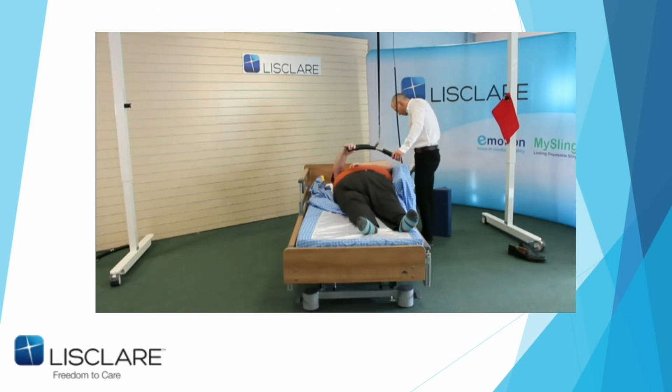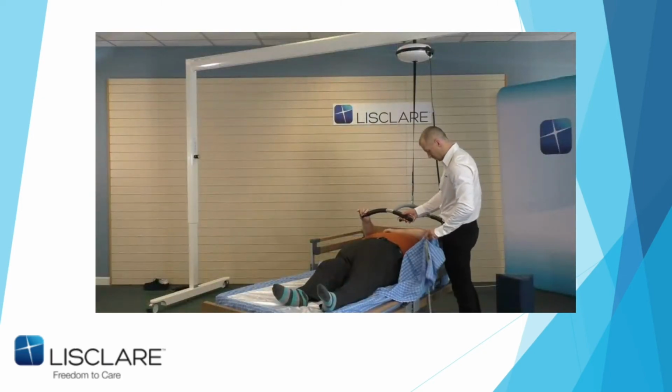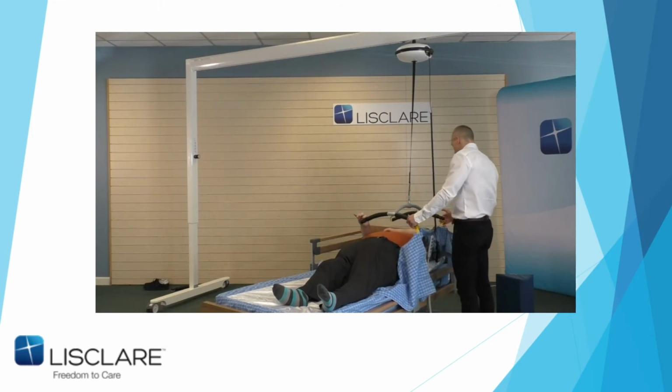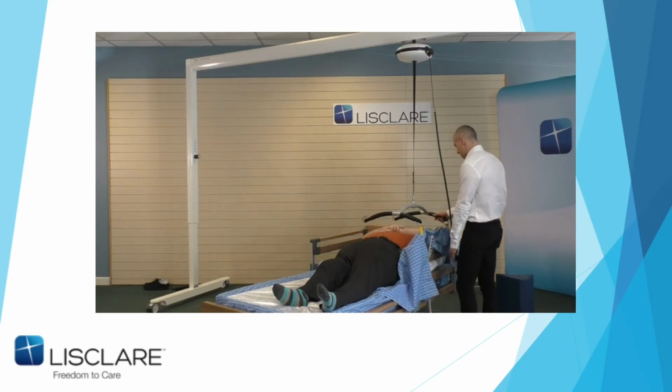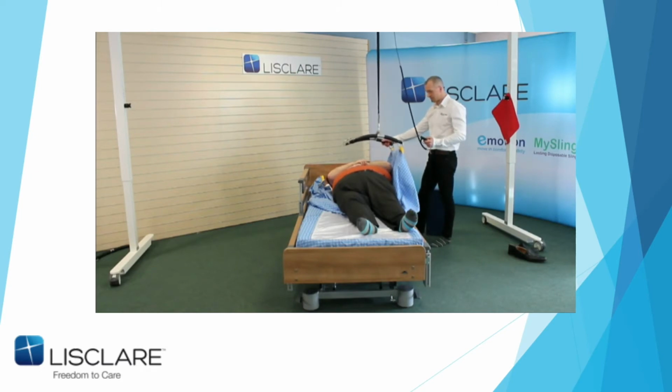Now, again, you heard my size and weight. I'm going to try and stop this turning me. Just to show you that once this goes, you go. Up you go, John. I'll just get the wedge ready when you're just behind the jump. Wherever it is. This is designed to do this, so don't panic. That spreader bar will turn up like that.